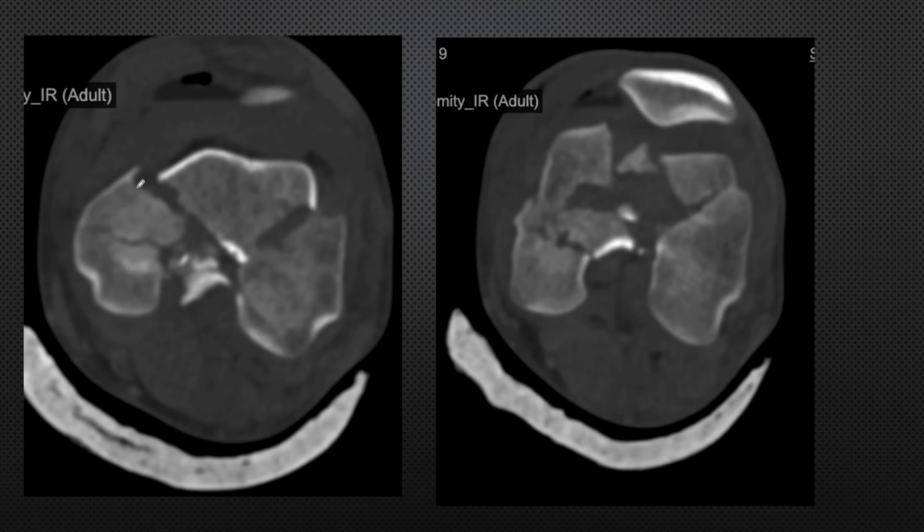And this part is the medial side. You see comminution is there, some kind of impaction is also there. You see this white density is because of the dense impacted bone. And there is comminution on the notch part.